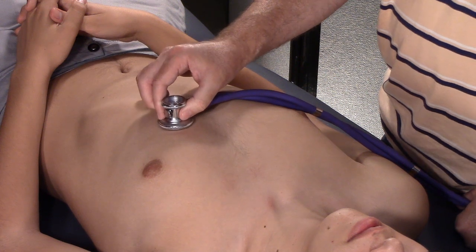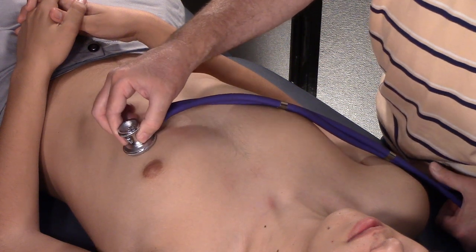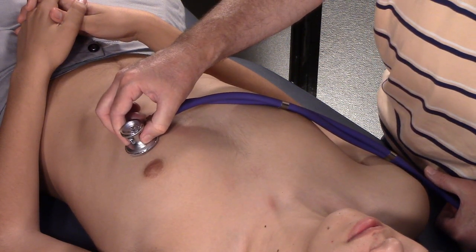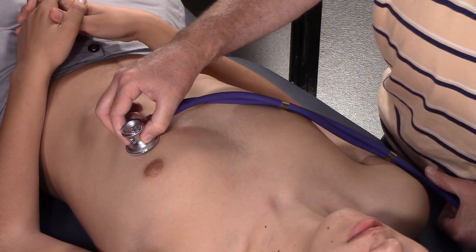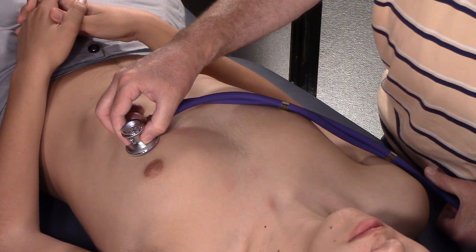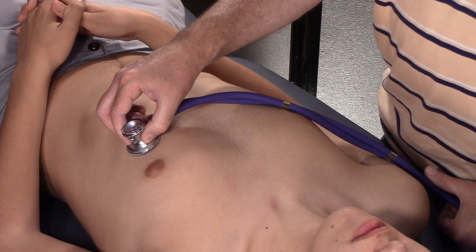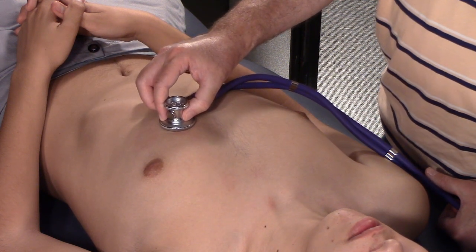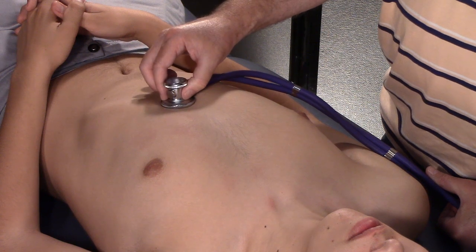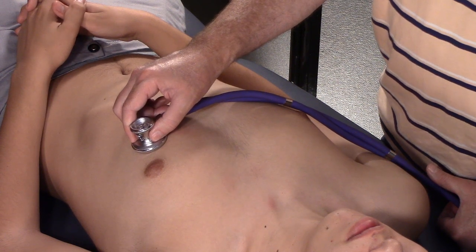We're at the bottom — the fifth intercostal space. Now we inch our way out to the fifth intercostal space, mid-clavicular line — that's the apex of the heart, usually the PMI. PMI is the point of maximum impulse, which is usually the same as the apical impulse — but not always. For example, in right ventricular hypertrophy, the PMI might be at the left sternal border at the fifth intercostal space, or down at the xiphoid.